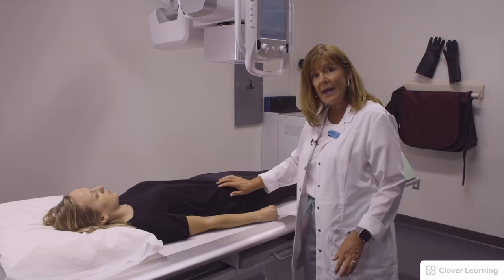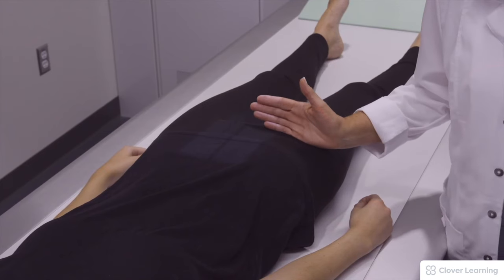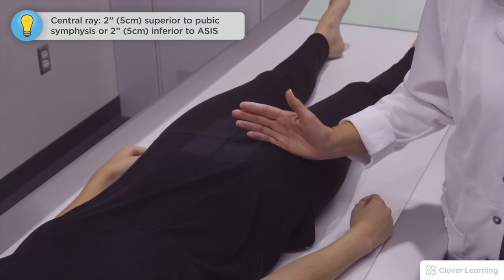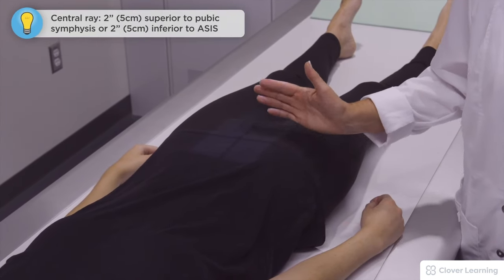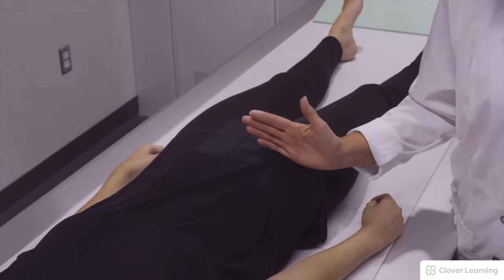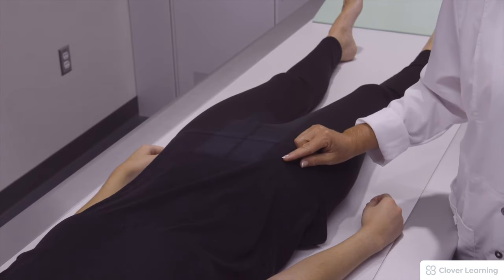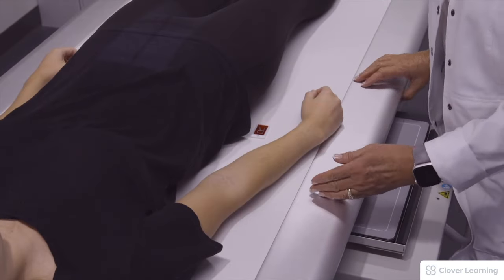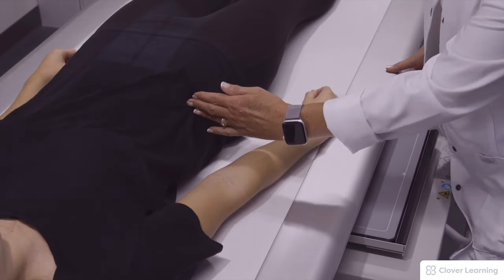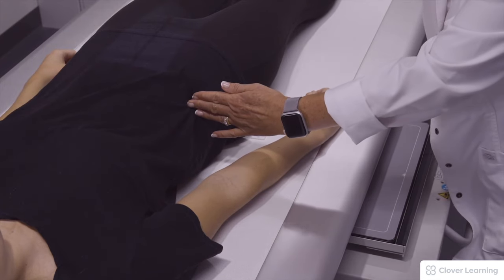My central ray is going to be two inches superior to the pubic symphysis, or two inches inferior from the ASIS. Our IR margin is an inch above the iliac crest.